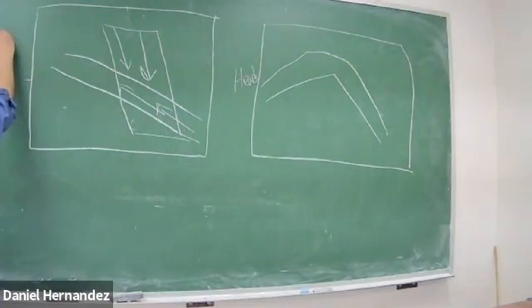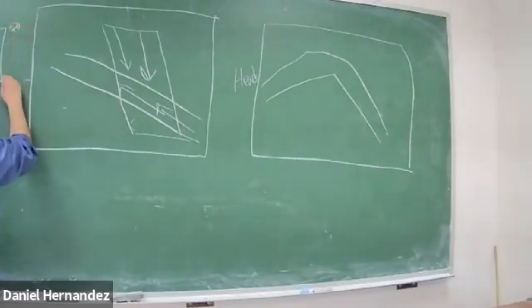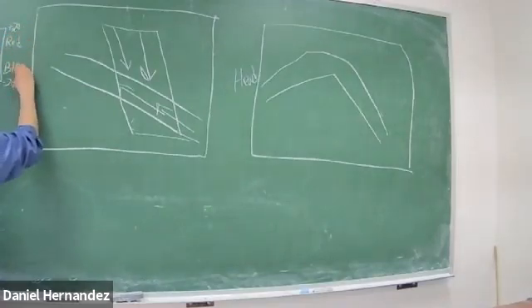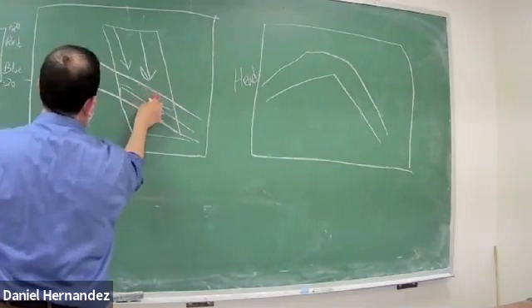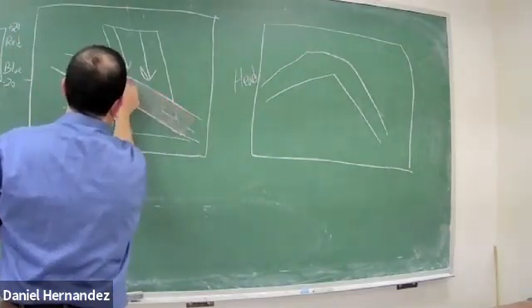If we're doing our scale, we have positive 20, negative 20, and we're making the positive red and the negative blue. Since it's coming towards us and we have a positive shift, it's going to appear as red.